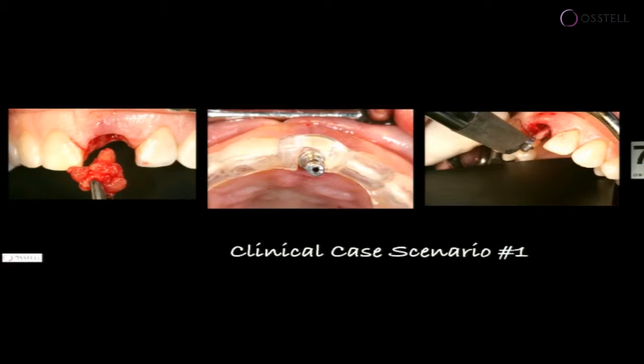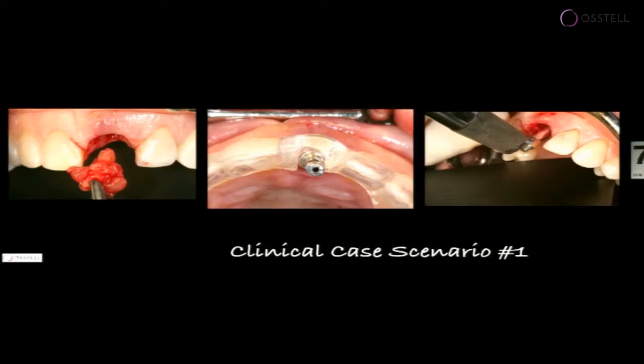And once the implant has been placed, we take this measurement and see an ISQ reading of 73-78. Jeff, would you like to comment on this double number?